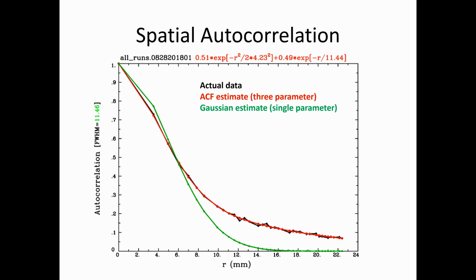And so what AFNI developed in response to this mismatch was an autocorrelation function, a 3-parameter model. We talked about that briefly, that can map the red line better onto the black. So now when you recreate your noise data, you aim to have noise that follows that more realistic blurring function, that allows for longer tails in your data and allows for more distal data influencing the noise and inflating the autocorrelations that way. So inflating the false positives.